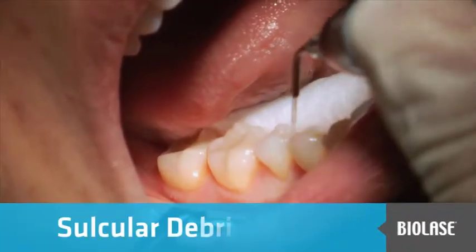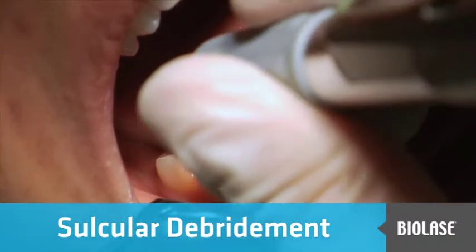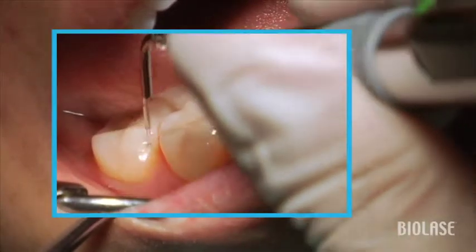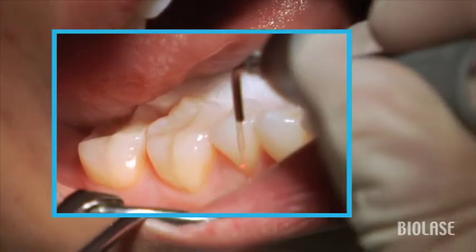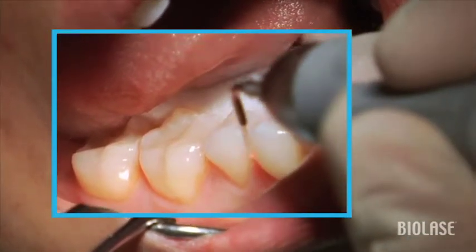When a patient presents for sulcular debridement, there's a certain sequence that we want to follow. If we're going to go from the distal to the mesial of the quadrant, we really don't want to travel from the distal to the mesial of each tooth. We don't want to do this because we're going to end and begin in the same papilla, and this is going to deliver too much heat to that papilla.